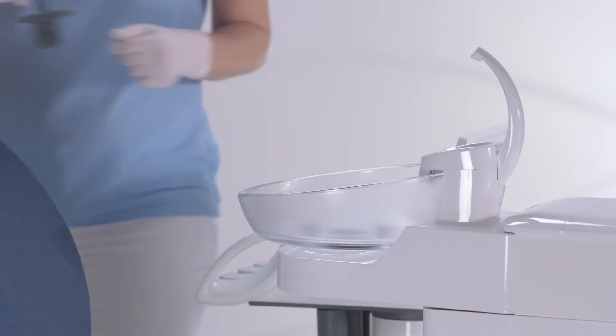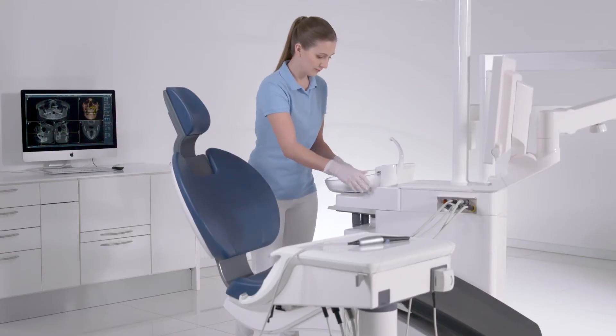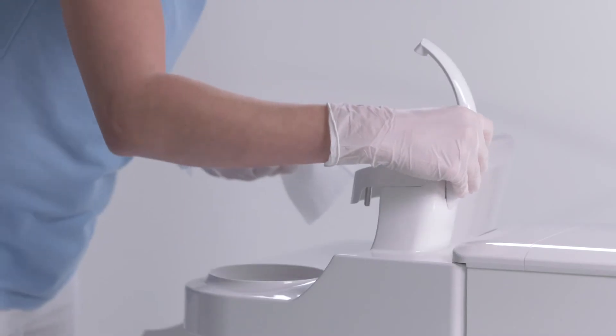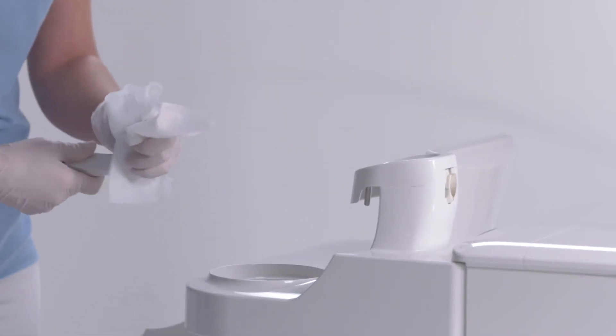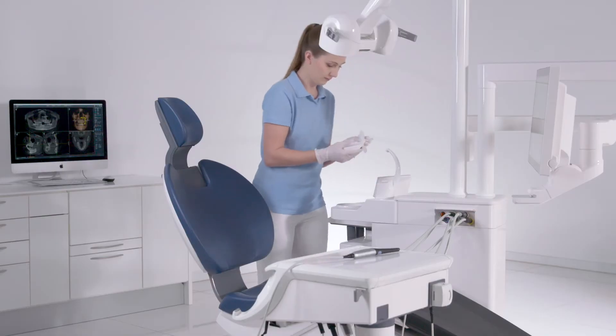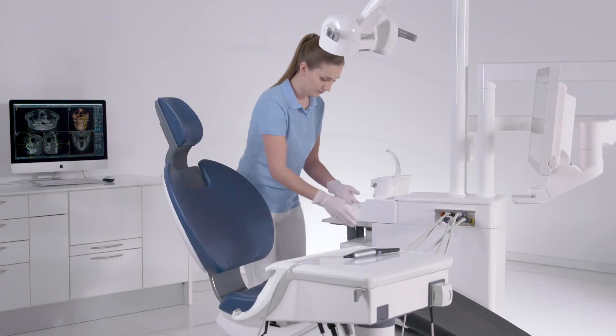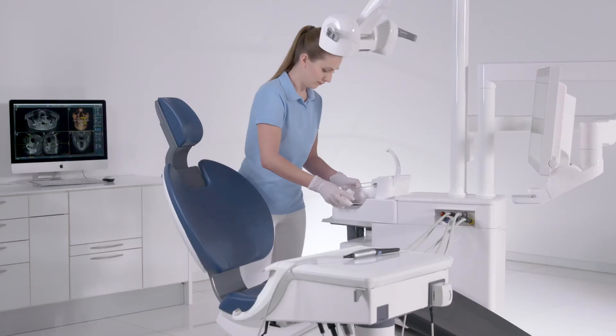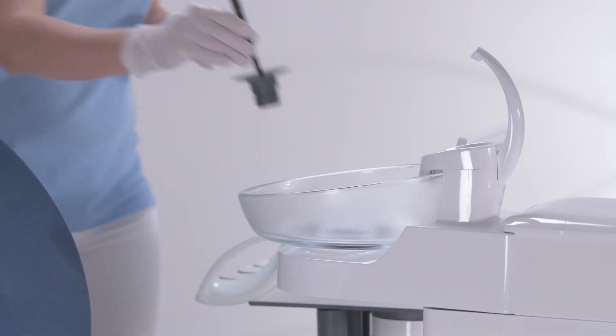Remove the gold trap and then take off the cuspidor for thorough cleaning. Now, clean the tumbler filler, the cup holder, and the swivel unit. Then, reattach the cleaned cuspidor and the gold trap.